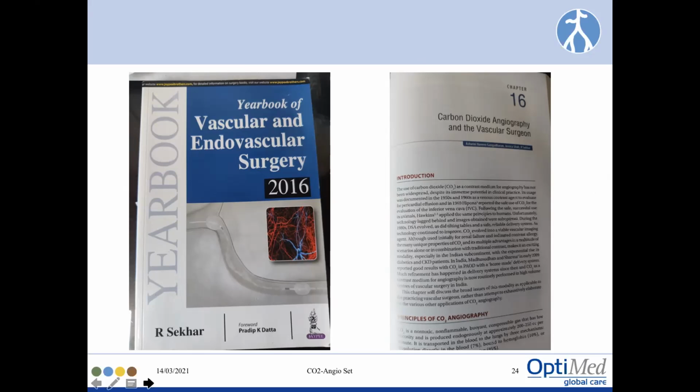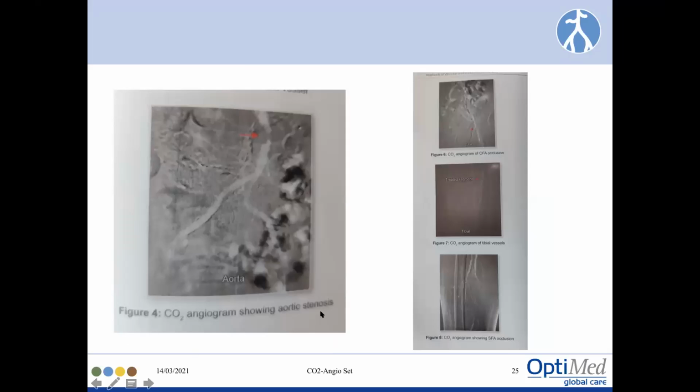It has all the details of how to get started, and what technical adjustments you need to make, and what is the literature on it, and what you should do and what you shouldn't do while doing a carbon dioxide angiography. These are some of the pictures I've shared from the book.